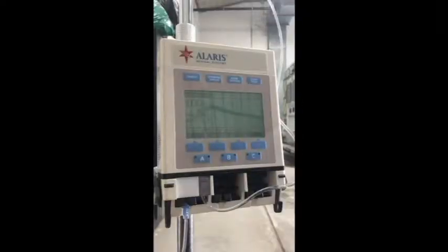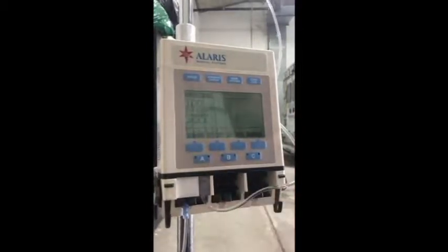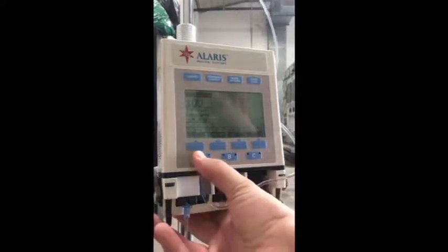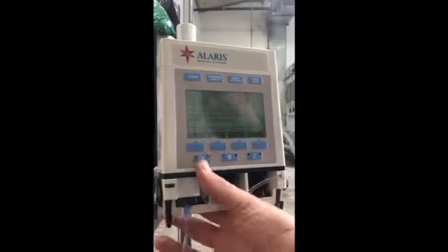So you were going along normal and then this happened. Here we can see both the green and red, I'll let it quiet first. That would indicate that it's still going, but it needs to be addressed. So channel A: keep vein open, and you'll notice keep vein open is 3 mLs per hour. So it still is infusing, just at a very slow rate. So we can press A to repeat previous settings, or to set new values, then press start.